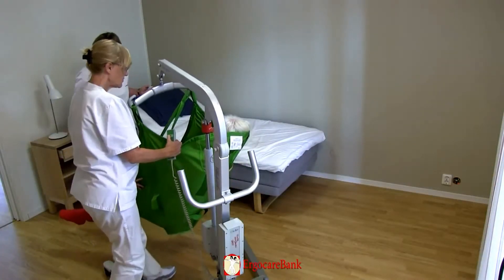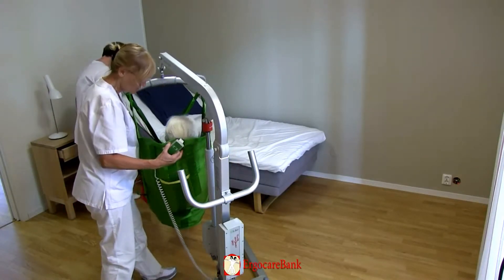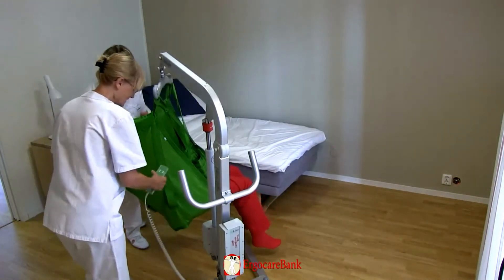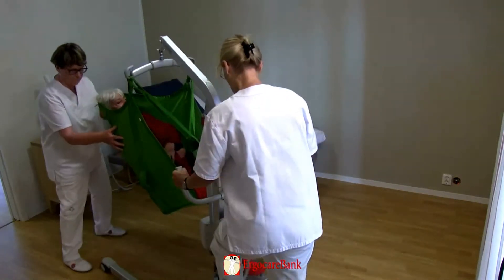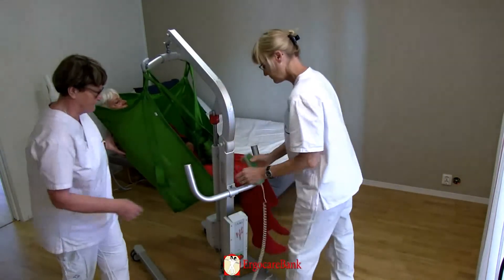The staff turn Celia so that she faces the lift, taking care not to hit her feet. The hoist is moved over the bed, and Celia is lowered so that her back rests onto the raised head end of the bed.